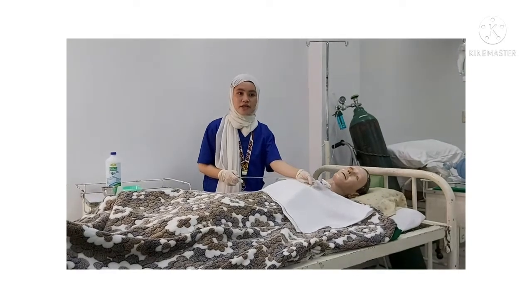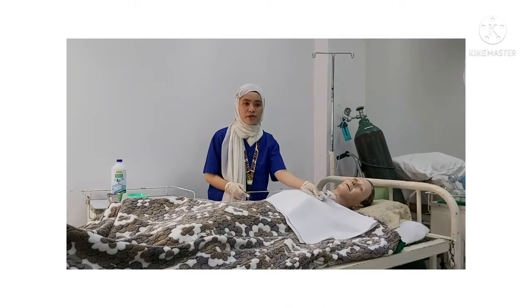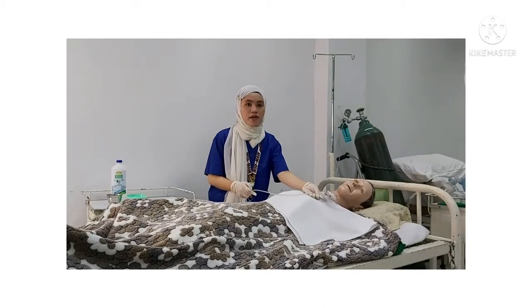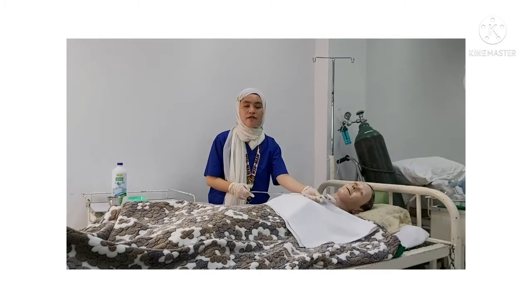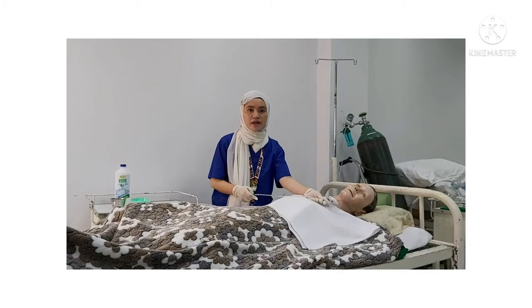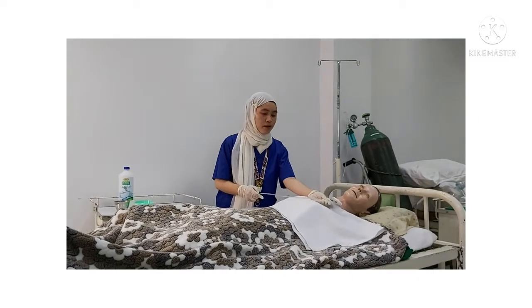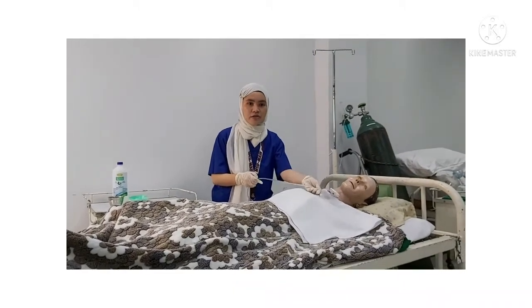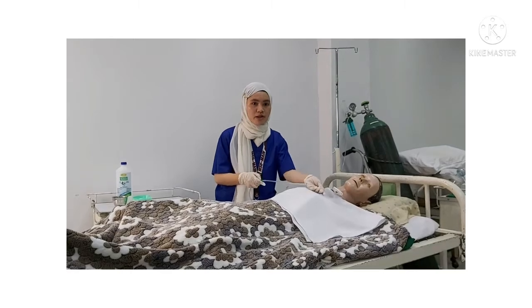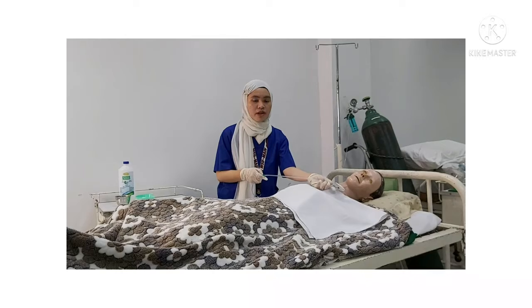Now insert the catheter about 6 inches for adults, or less for pediatrics, or until the patient coughs or there's a resistance. It usually means that it has reached the bifurcation of the trachea. Now suction for 5 to 10 seconds, gently rotating the catheter by rolling it between the thumb and the forefinger while slowly withdrawing the catheter.